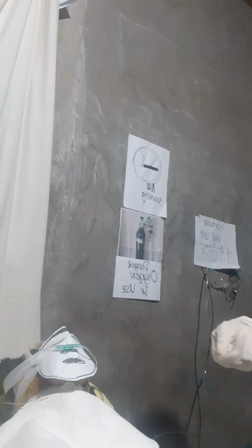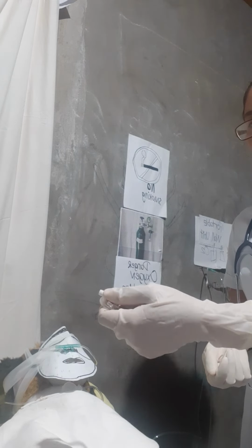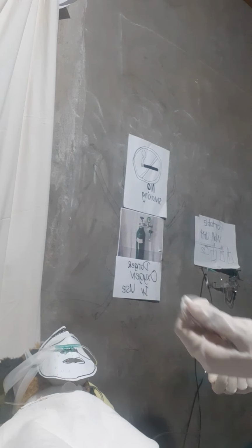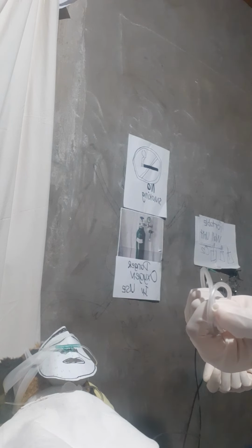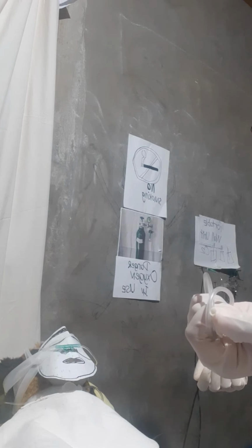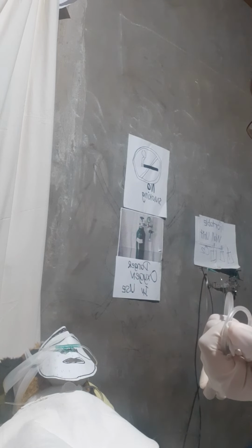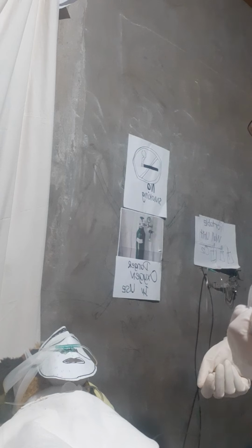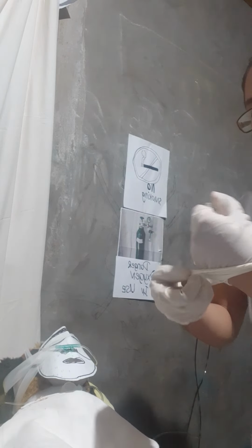When suction is complete, we remove the gloves from the dominant hand, and the catheter should be coiled. The coiled catheter is here, and pulling the glove off inside out.